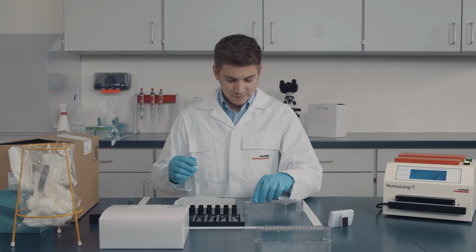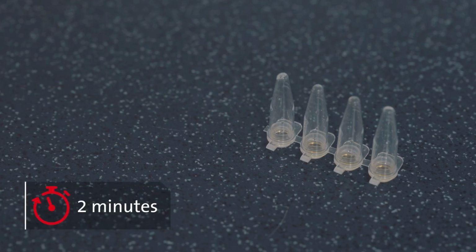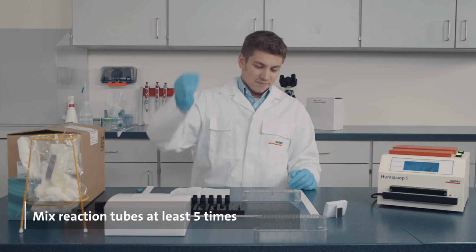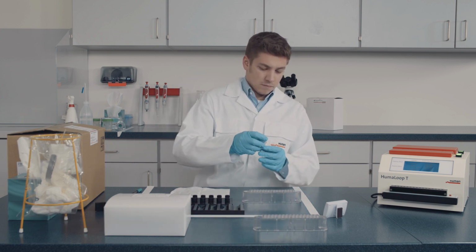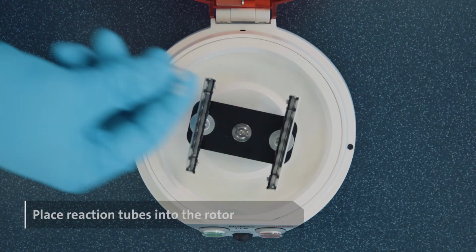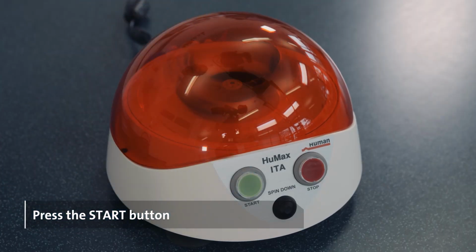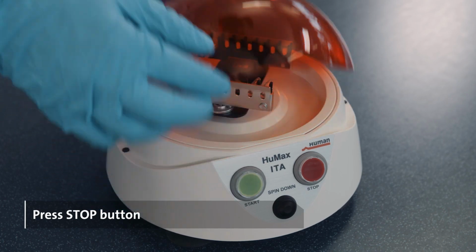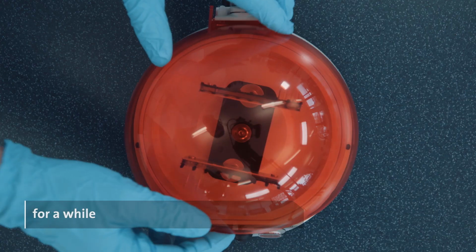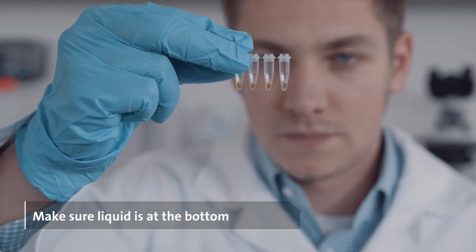As the reagents are in the lid, turn the tubes upside down and let the LAMP reagents reconstitute for 2 minutes. Now mix the reaction tubes at least 5 times. These manual steps could also be done by HumaLoop T. Make sure that the colored solution is at the bottom of the tubes when you finish the process.